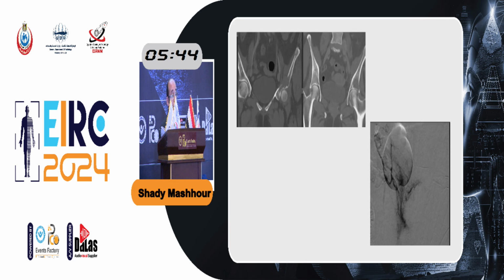This is another patient. She did not have a fracture, but had metastatic renal cell carcinoma. She had surgery on her tibia. However, it was very bloody, so the surgeon refused to operate on the pelvis. So we went for an embolization.